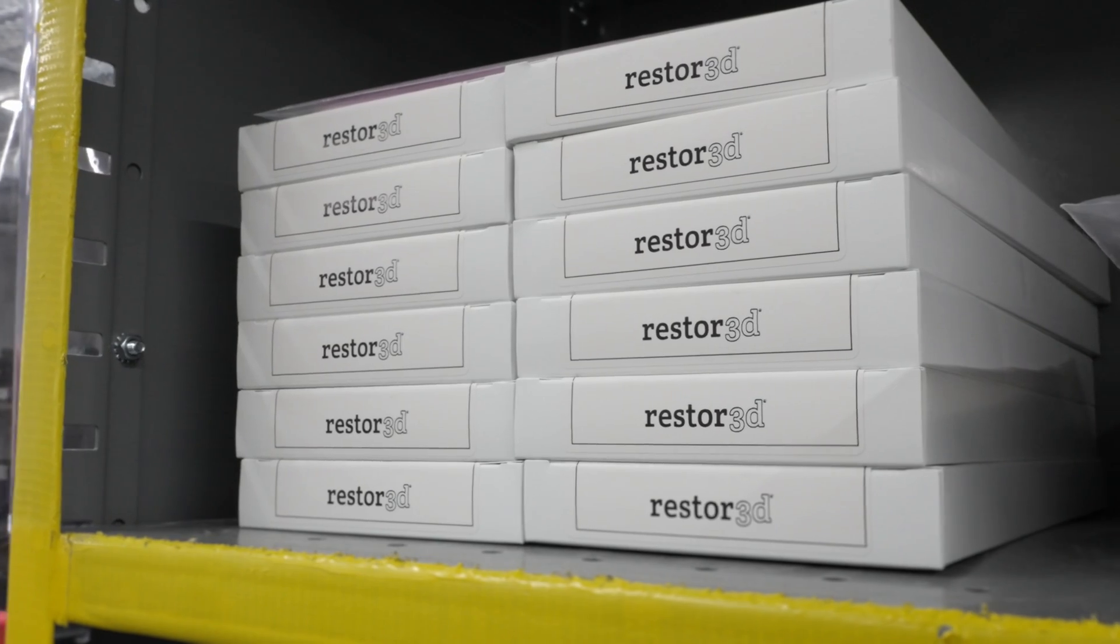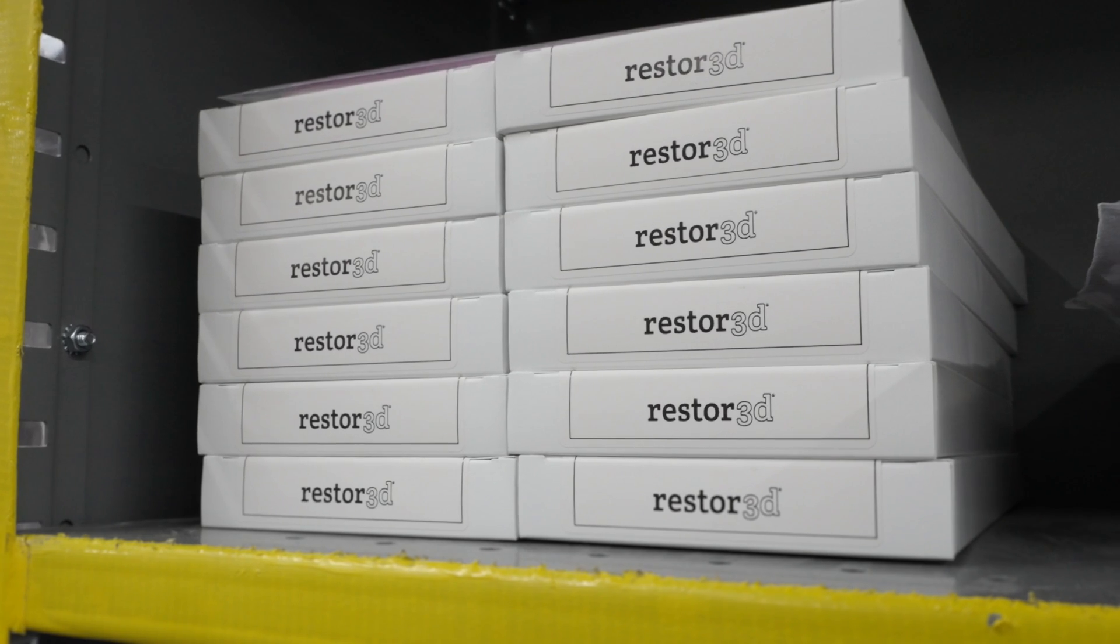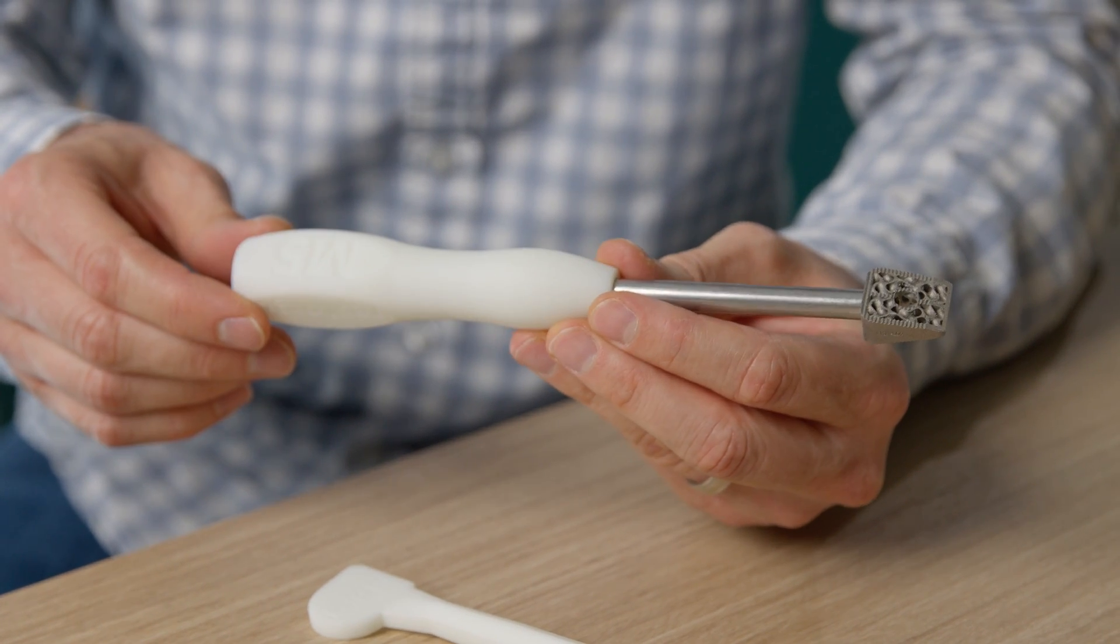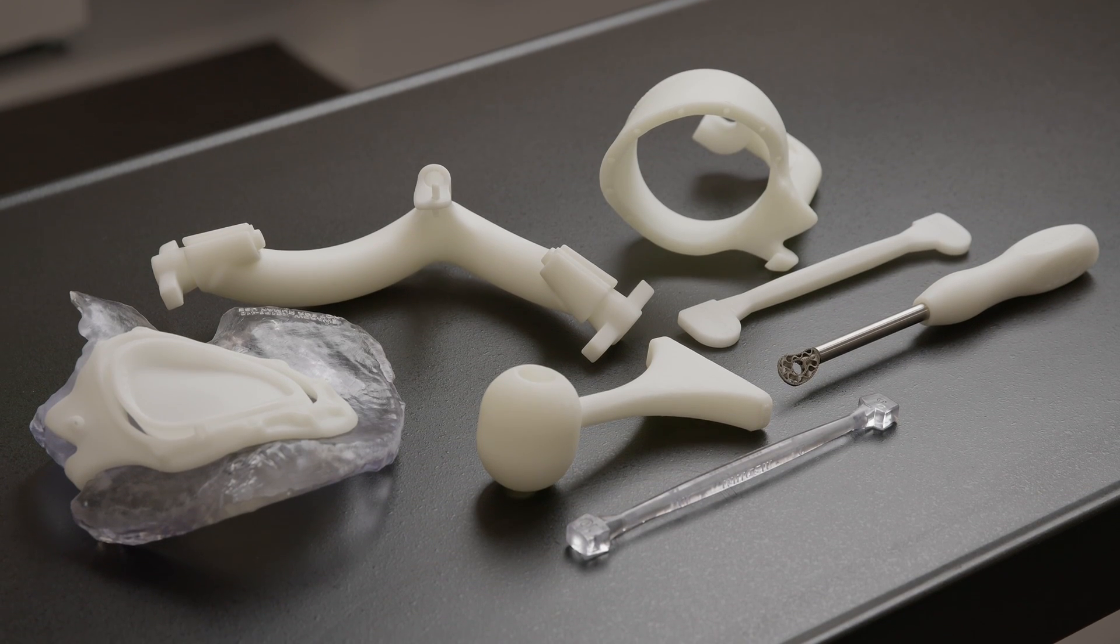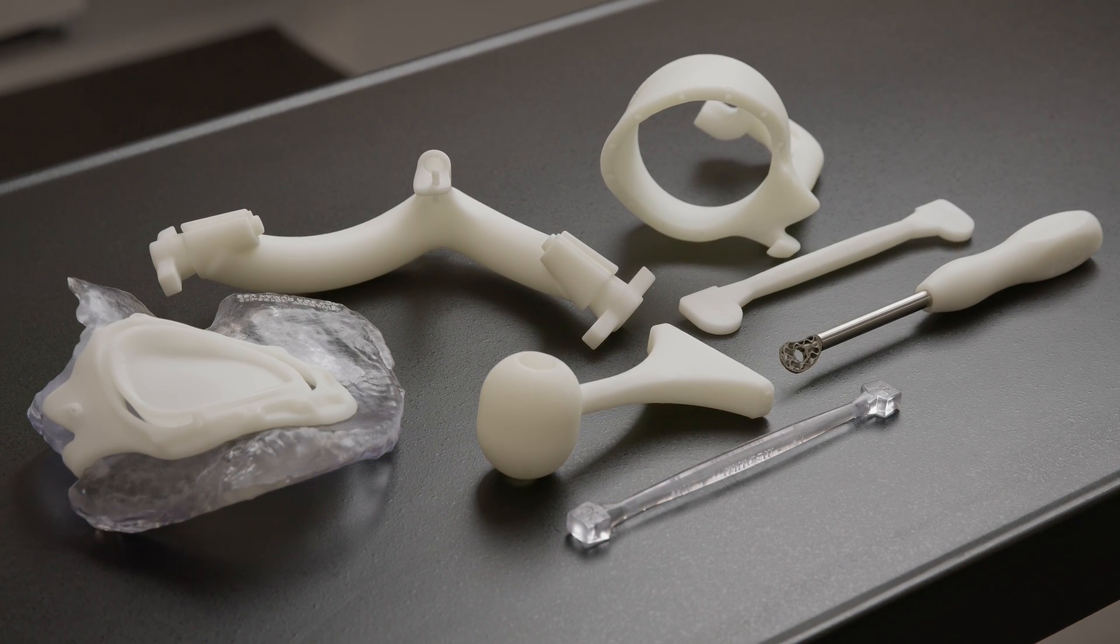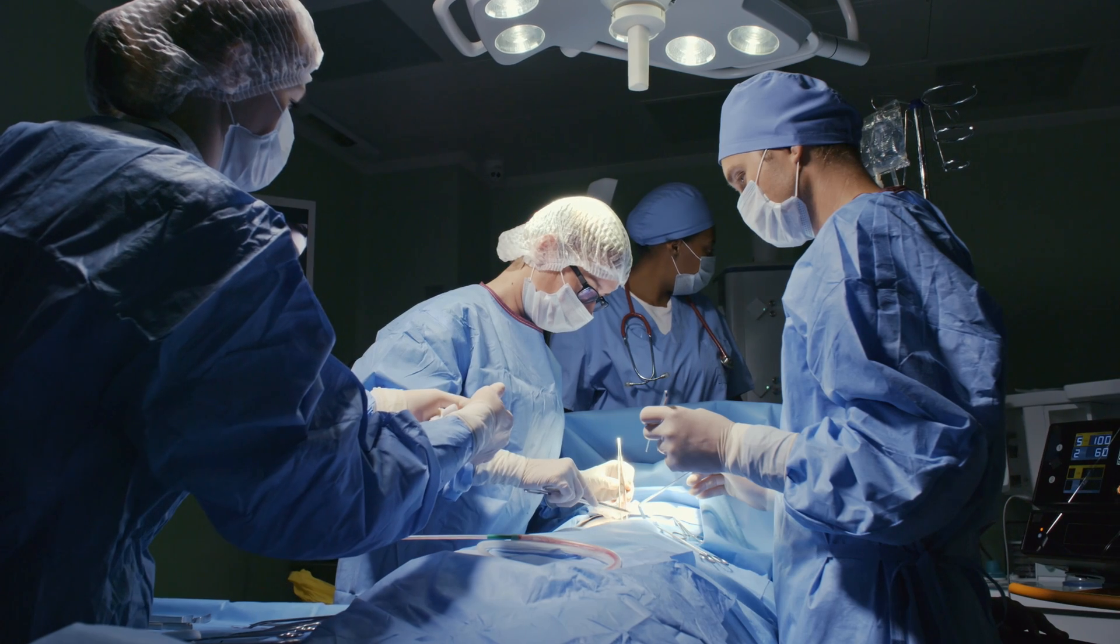We also use them for our patient-specific custom devices that are made on a one-off basis: cutting guides, inserters. What we do in orthopedic oncology is inherently creative.